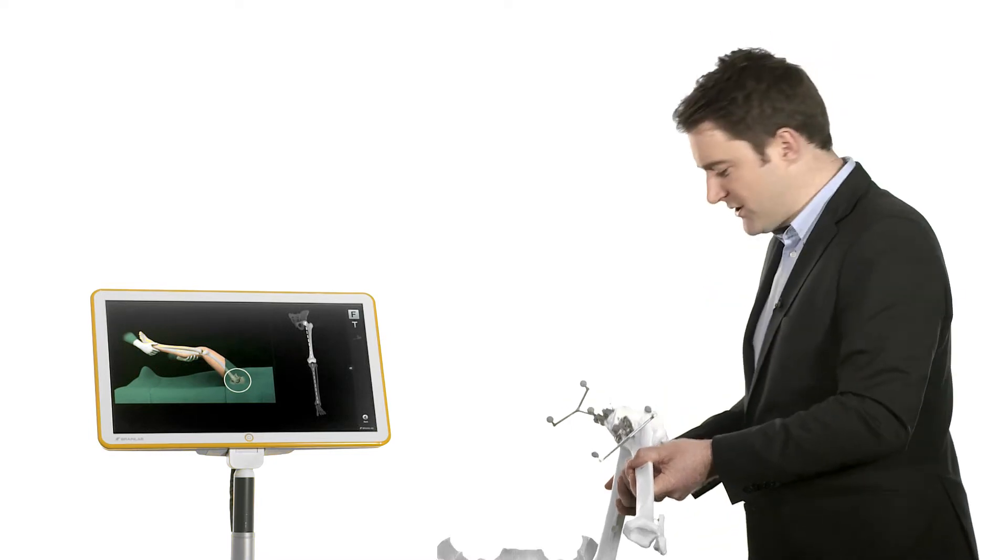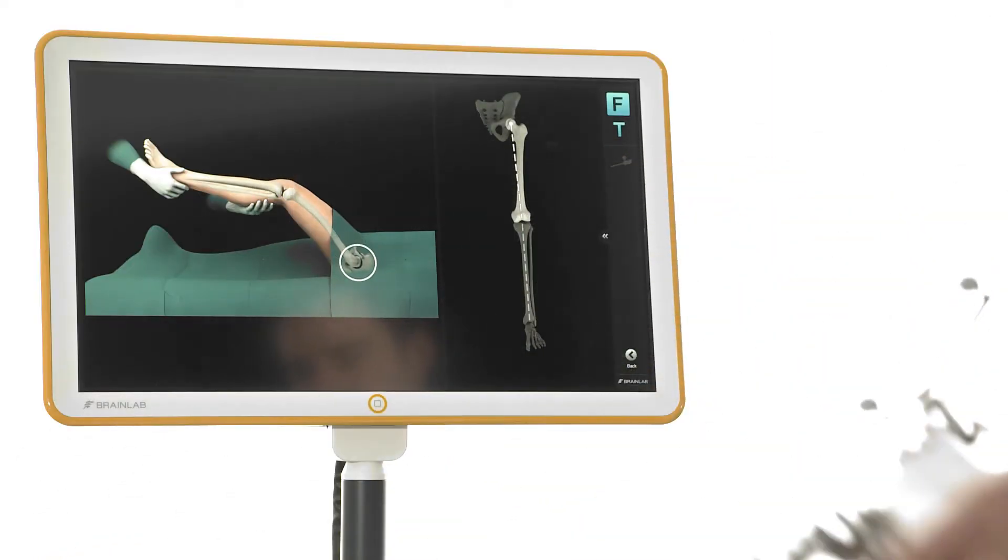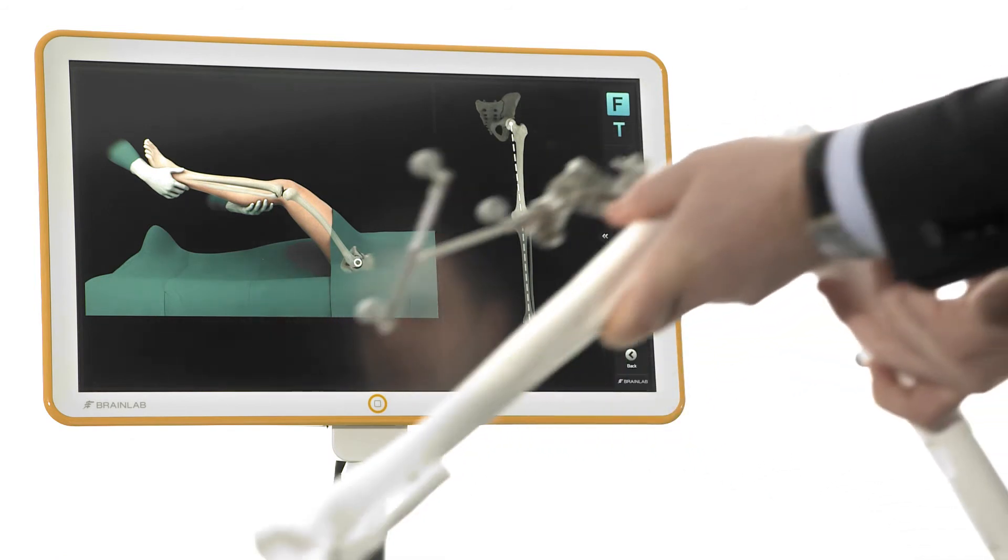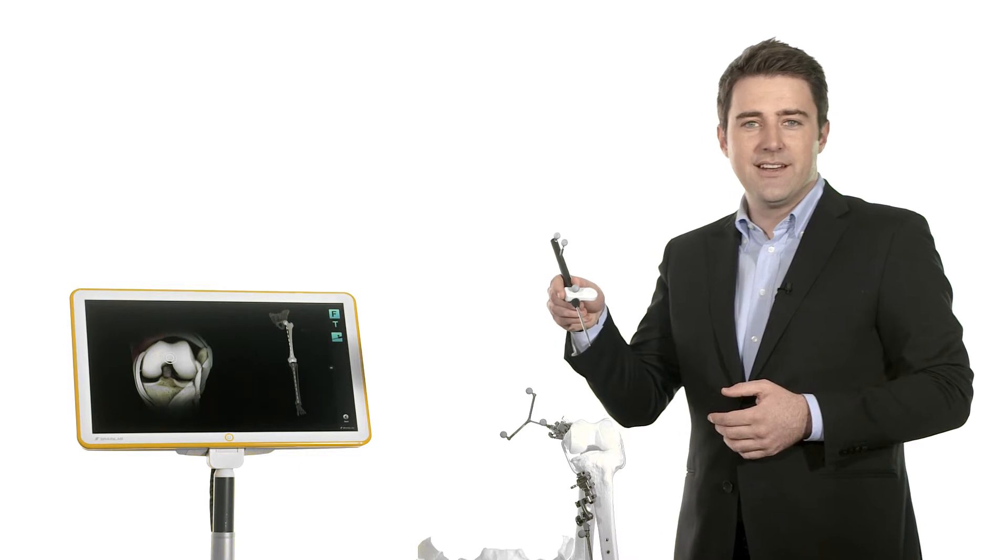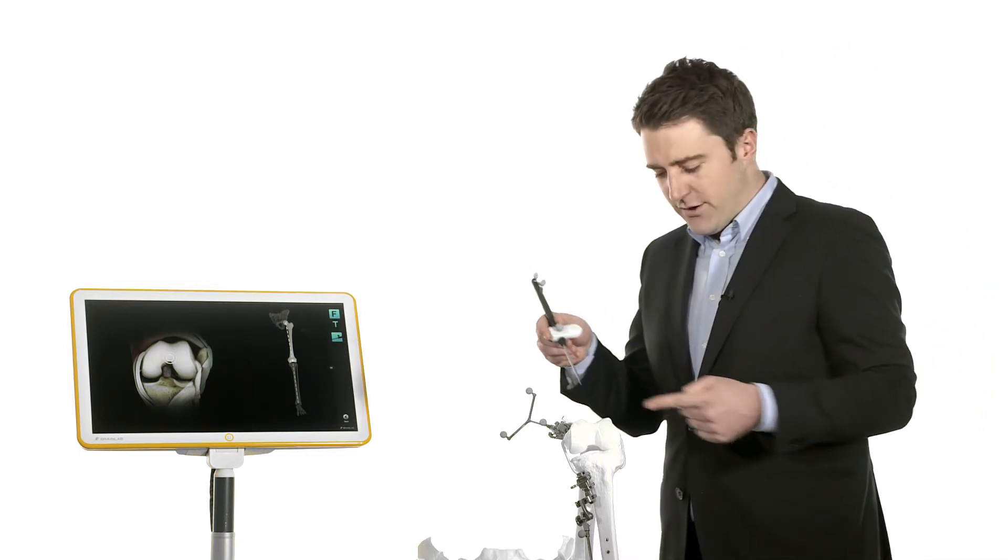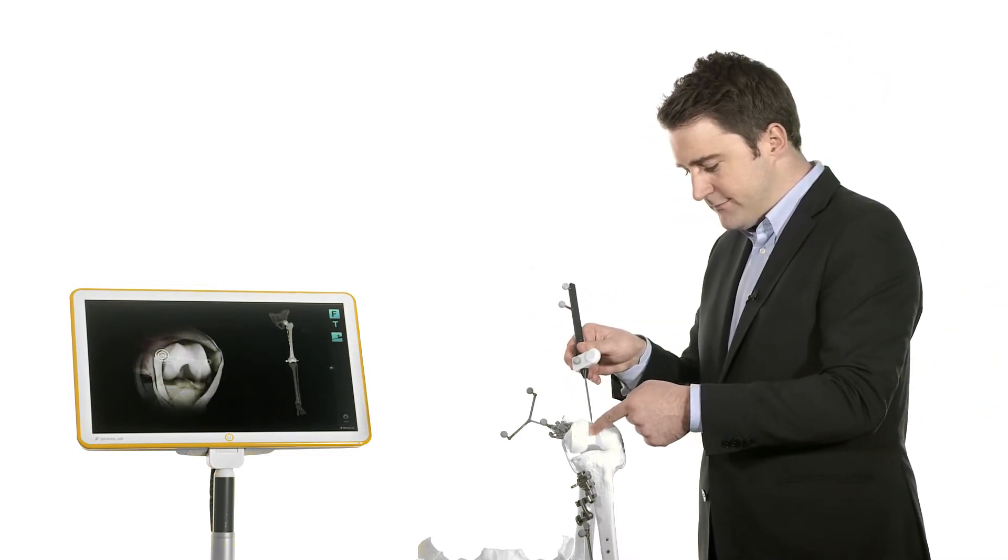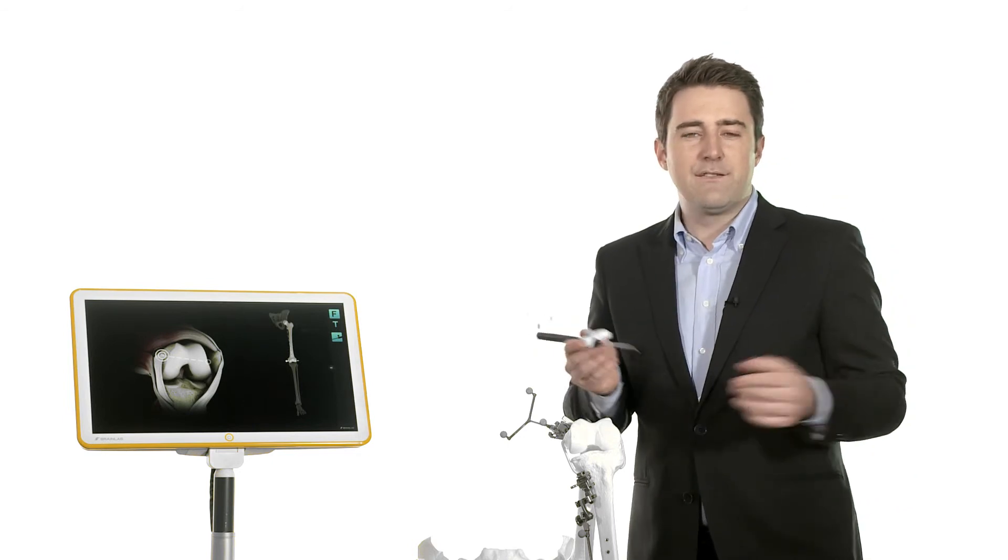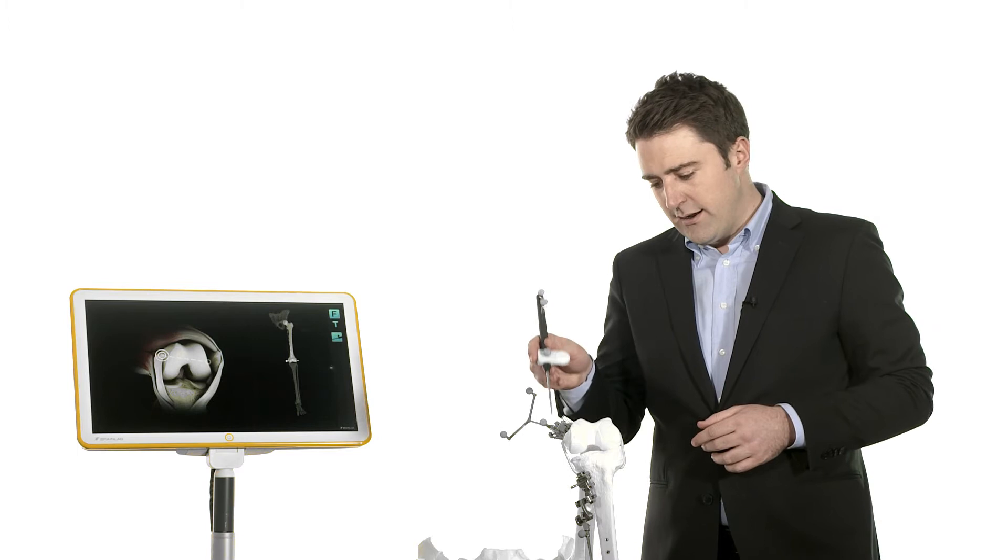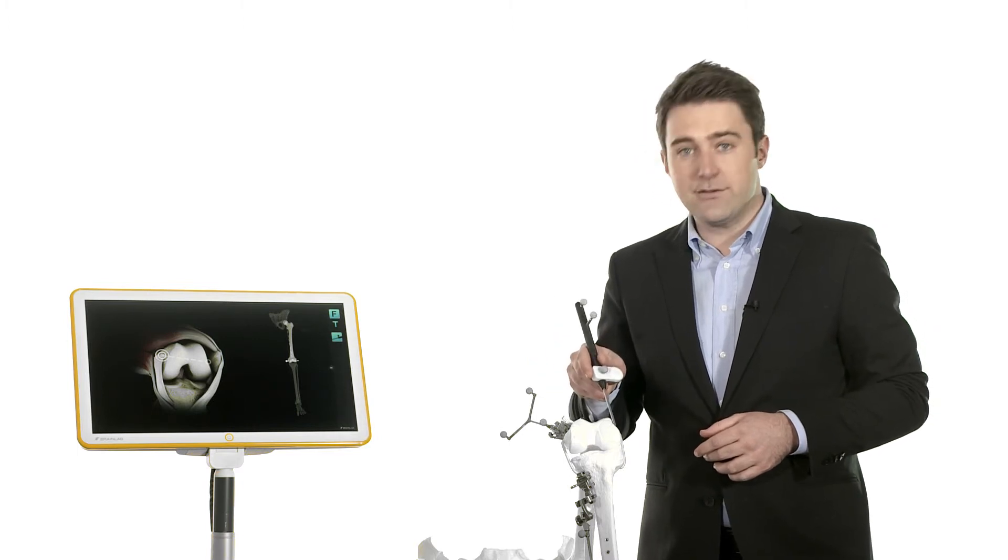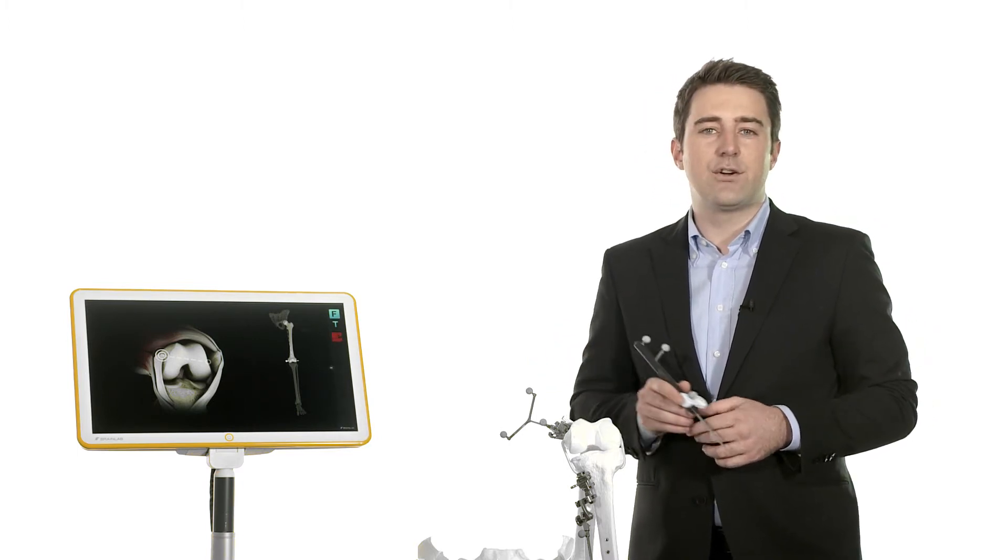Registration begins with the acquisition of the femoral head center. Using the pointer that is equipped with reflected marker spheres, the mechanical axis of the femur is registered. The remaining femoral and tibial anatomical landmarks are subsequently acquired until the software has received all information necessary for calculation.